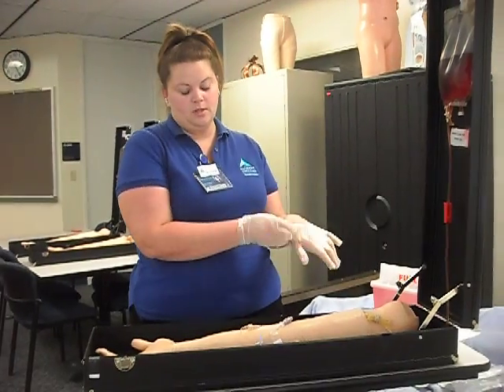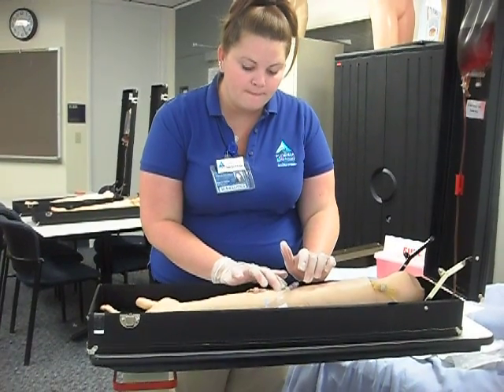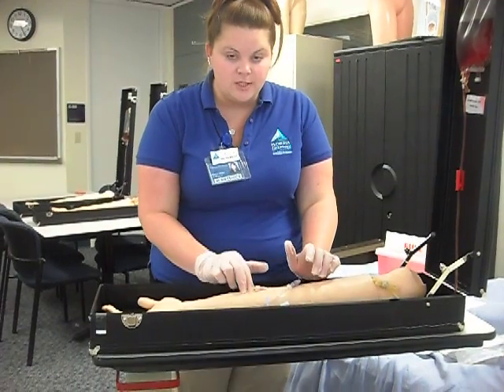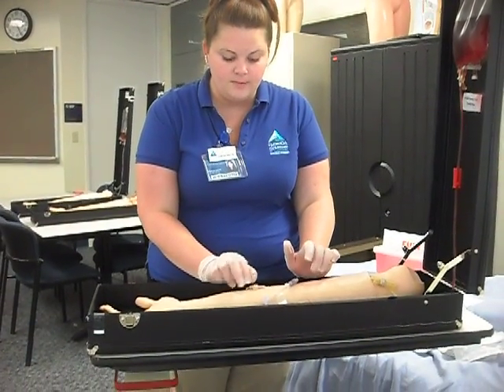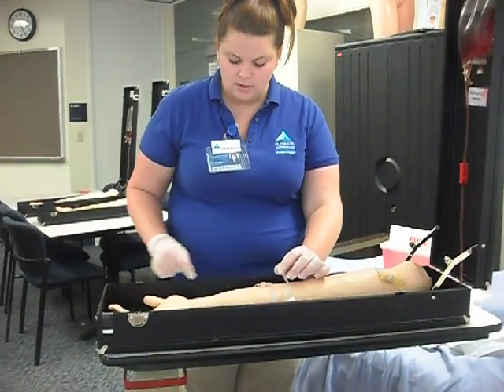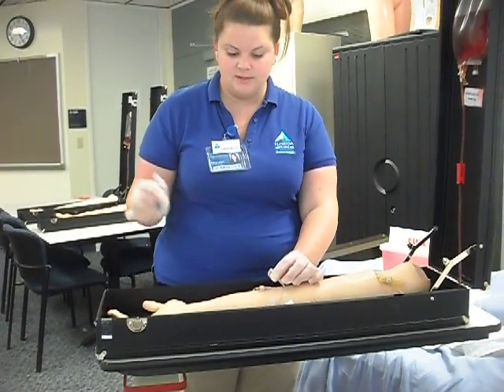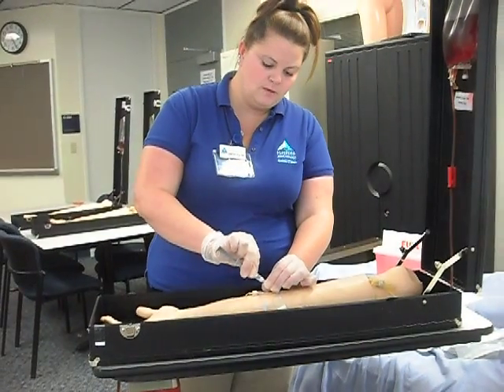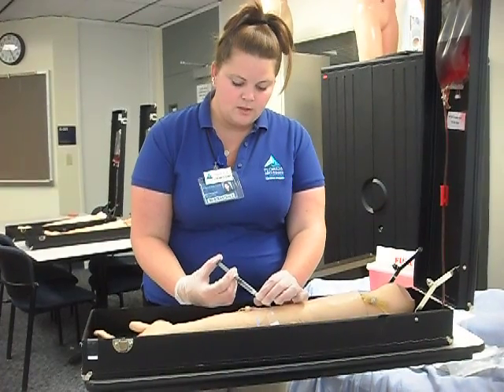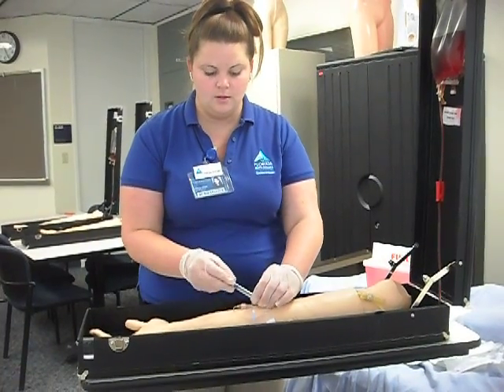I am going to palpate their IV site to check for redness, edema, pain, infiltration, which is cool, wet, and pale. And I'm going to clean the port site with alcohol swab, get my pre-filled saline syringe, and flush the site. I'm going to flush it with the push-stop method, and with positive pressure I'm going to clamp it.